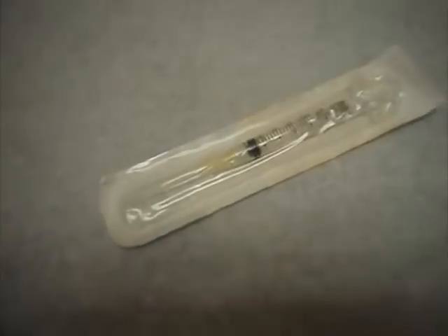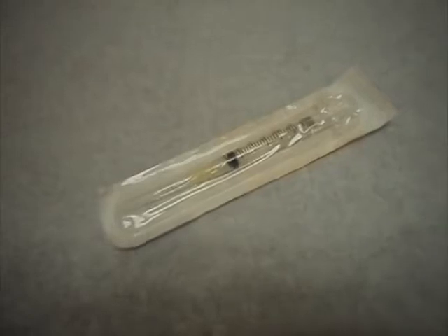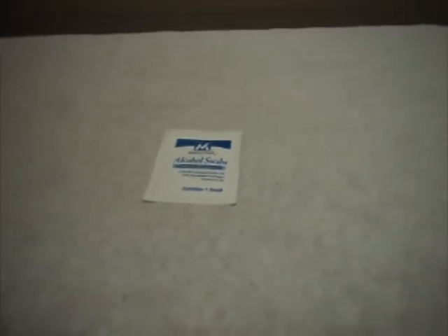You will need a syringe, which will be prescribed by your physician depending on your size and where you're going to inject. You will need the vial of B12, which can come in a 1-dose vial or a larger 10-dose vial. And you will also need an alcohol swab, or you can use a cotton ball with alcohol. Either is okay. The next step is to wash your hands prior to any preparation or injection of the medication.